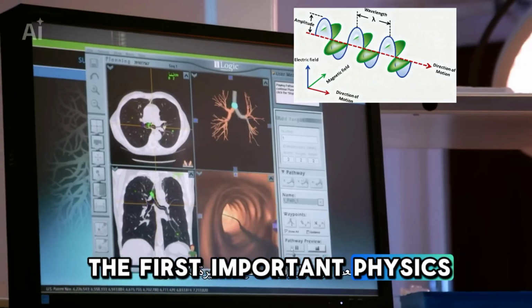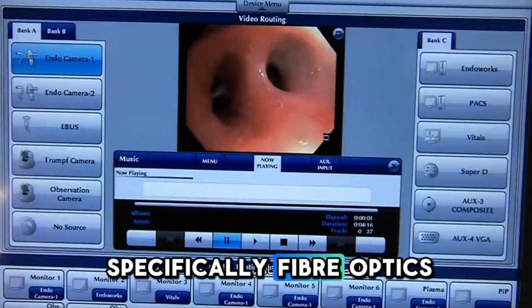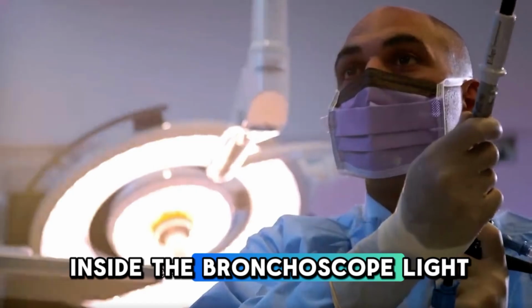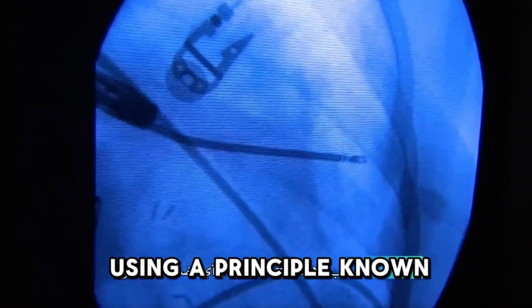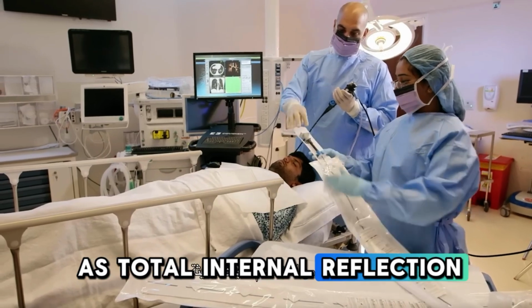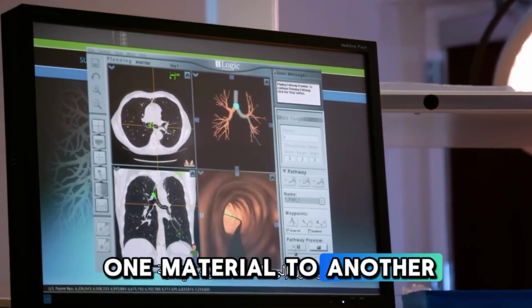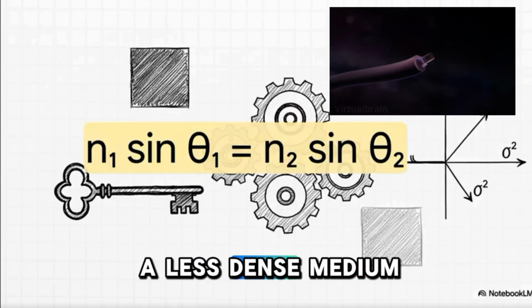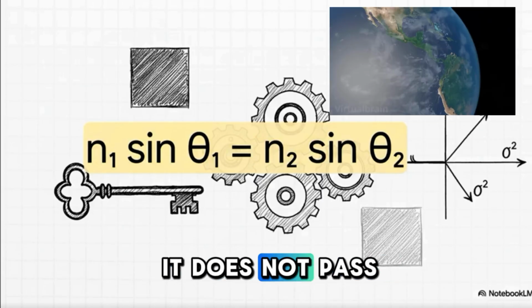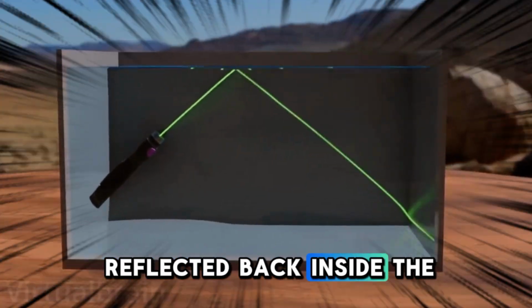The first important physics concept involved is wave optics, specifically fiber optics. Inside the bronchoscope, light is transmitted through optical fibers using a principle known as total internal reflection. Snell's law describes how light behaves when it moves from one material to another. This is the formula. When light travels from a denser medium to a less dense medium at a specific angle, it does not pass through. Instead, it is completely reflected back inside the fiber.